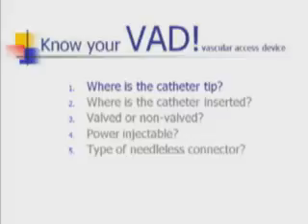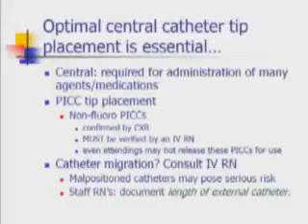Where is the catheter tip? Where is the catheter inserted? Is it valved or non-valved? Is it power injectable? What type is the needleless connector? Catheter tip location determines what types of infusions can safely be administered through them. Malpositioned catheter tips can have devastating consequences.